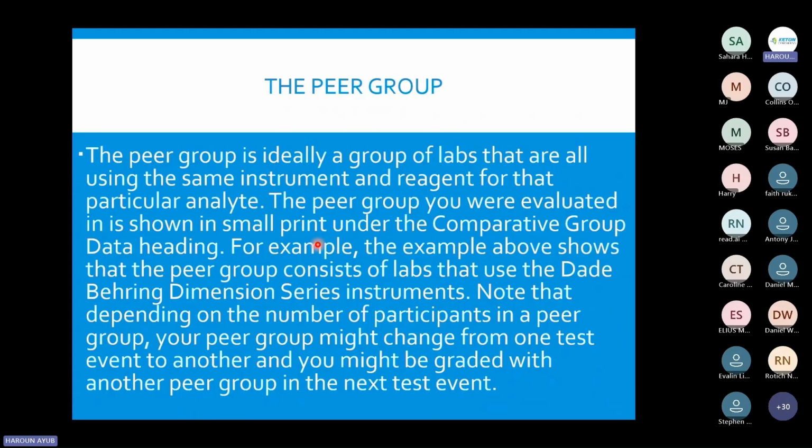And these are determined by the EQ provider once they do the analysis. Then we can also say that for this Sysmex XN series, there are only 3 participants. And then we have the Sysmex XE, Sysmex XS, but these particular groupings are from the Sysmex group. So we can also pull those groupings together and put them in a Sysmex group so that they are able to get the peer grouping. So if you have understood what the peer grouping is, then that's what it means.